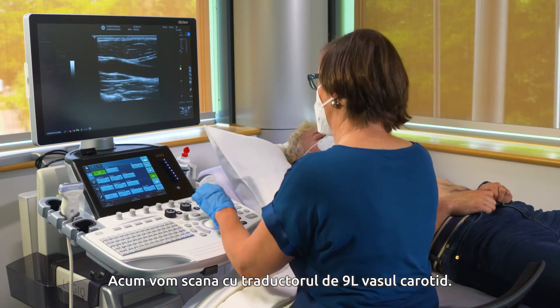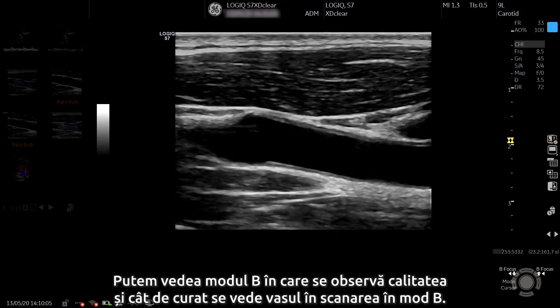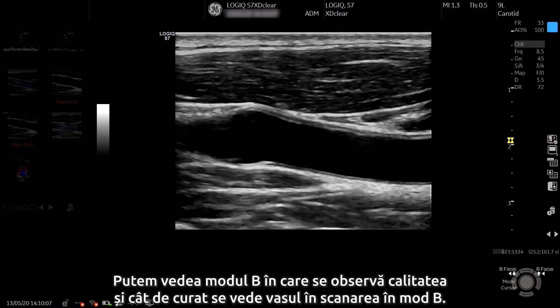Now we're going to look at the 9L transducer in the carotid vessel. We can see the B-mode image quality and how clean the vessel is seen in B-mode scanning.